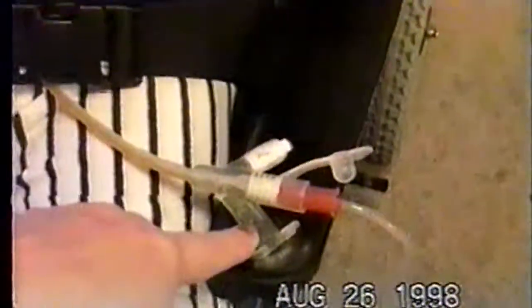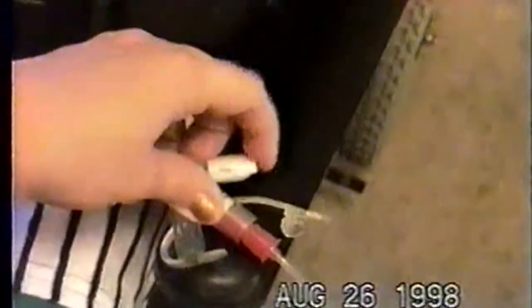Then this part — you really don't want any tangles in it. You will hook this red piece up to Cody's — hook it up right here, just like that. Do not put this feeding tube in this port. That port goes to his stomach, and if you put the port in there he's going to throw it up because he doesn't tolerate fluids in his stomach anymore. This port goes to his intestine. This port is just the balloon that keeps it in — that's how you deflate and inflate the balloon. So it goes in this tube. That's very, very, very important.